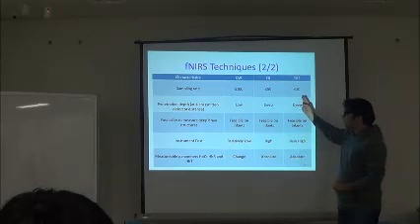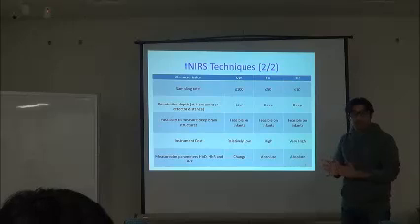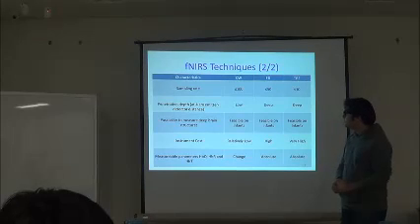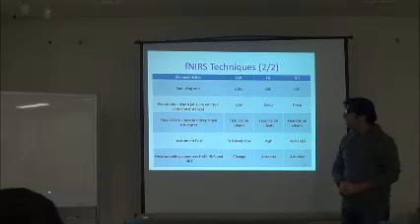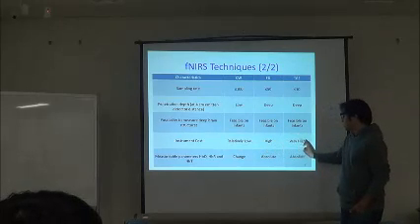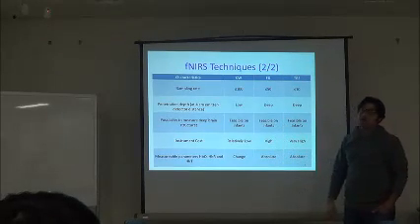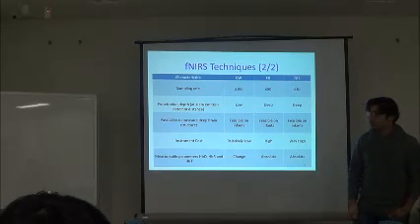The other thing is that the equipment is quite sophisticated. The equipment heats up quite regularly. We have to shut it down sometimes, this machine. So that's why usually the sampling rate of the time resolved spectroscopy is quite low. And as in here we can also see that the instrument cost of this is very high because the instrument is quite sophisticated. You need to have some high speed detectors which can not only detect but also count the number of photons arriving at the detector.